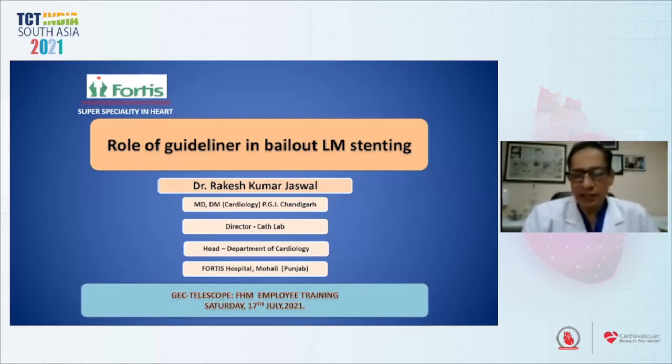All the interventional cardiologists who started doing intervention in the 90s are aware of the mother and child catheter that we had been using in certain tough situations. At that point of time, we probably never realized that this extended armamentarium of an interventional cardiologist would become so refined and user-friendly that we would be using it very frequently, maybe in about 20% of our cases.